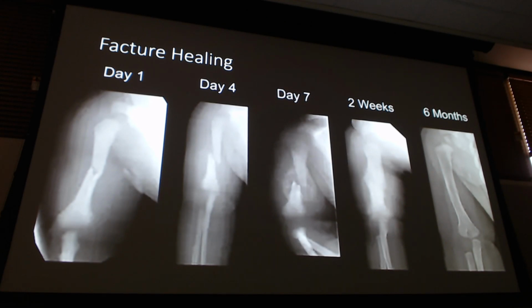Fracture healing. First of all, is this pediatric or adult? Do most adults have this large of a gap in their elbow? That's a knee trick too. Do you see a patella? Right? So this is the pediatric. This is the pediatric. So this is a younger one. This is much younger, right?